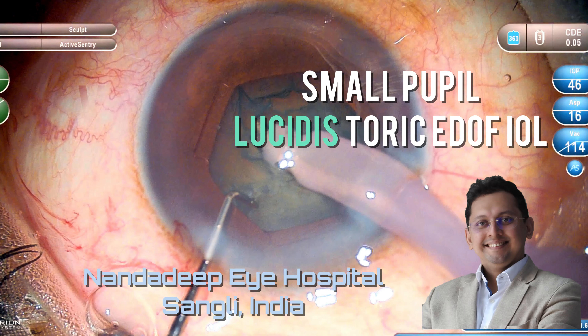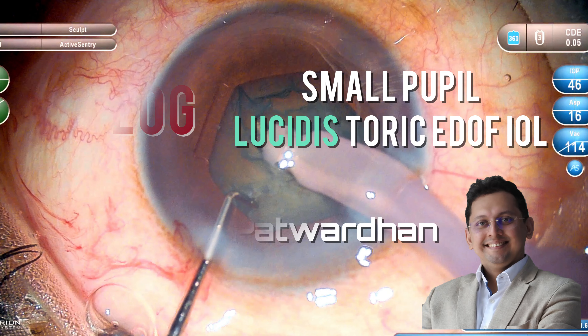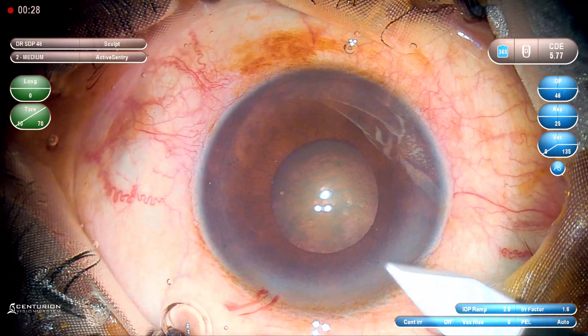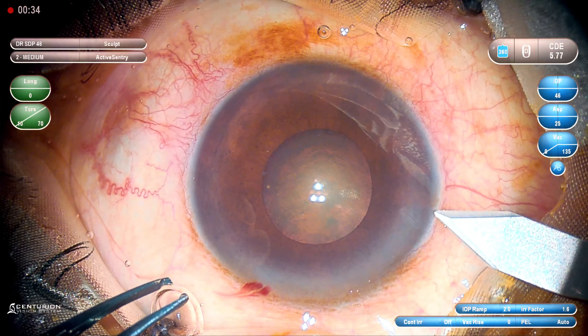In this video I will be dealing with a case of small pupil. There is some pseudo exfoliation and I am going to implant a Lucidis IOL, which is an extended depth of focus IOL. This is a 65 year old patient who has got bilateral pseudo exfoliation and you can see that the pupil is not dilating well. So the plan is to use the B-hex pupil expansion device.